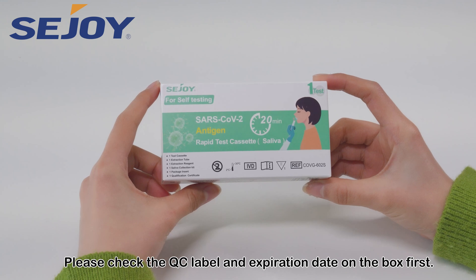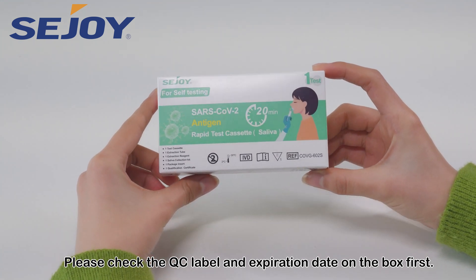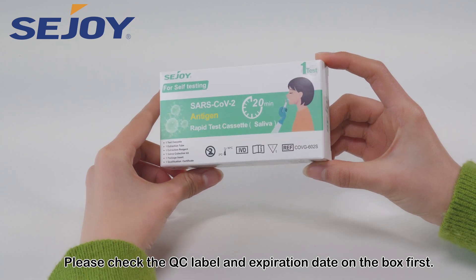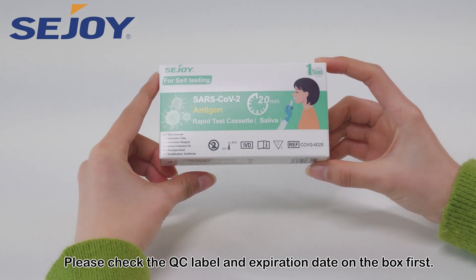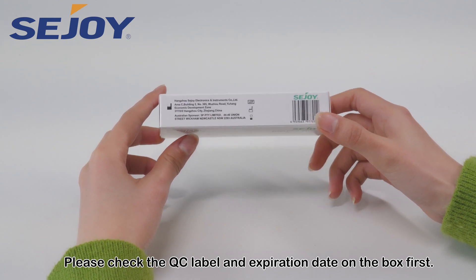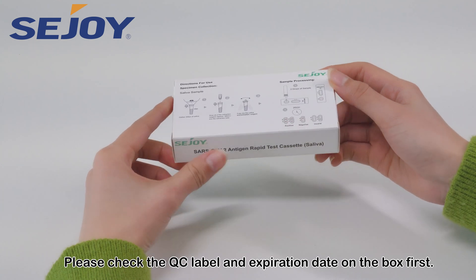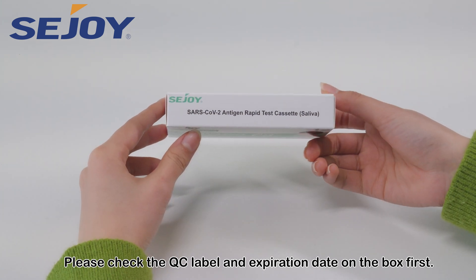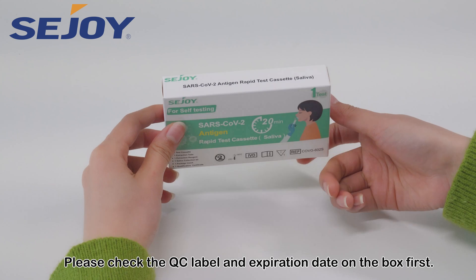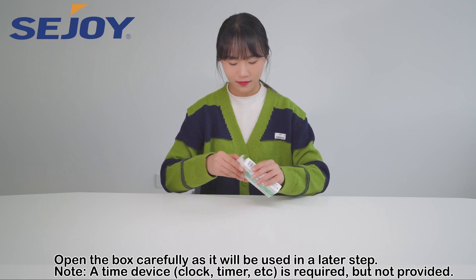Please check the QC label and expiration date on the box first. Open the box carefully as it will be used in a later step.